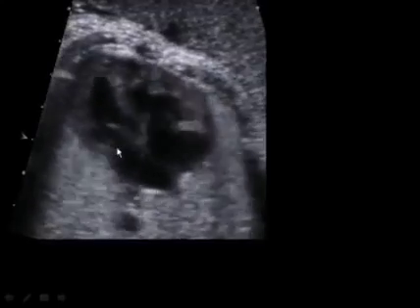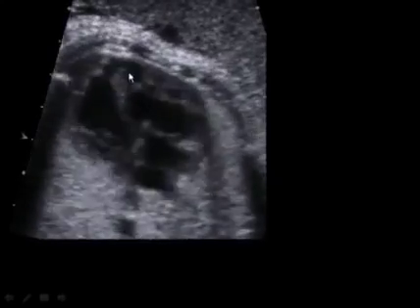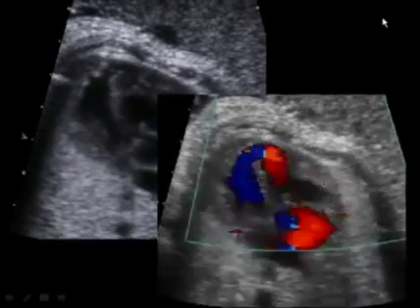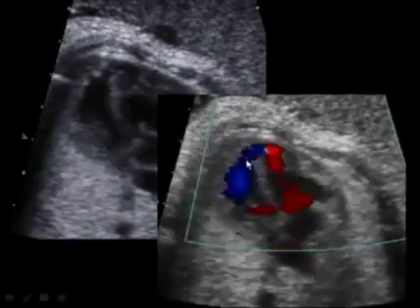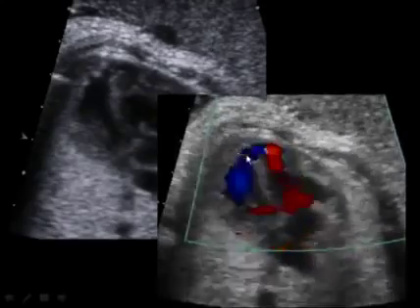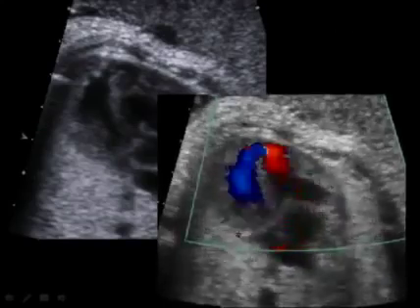Another what looks like a beautiful four-chamber view. We can see the tricuspid valve and the mitral valve, but if you look here on the very top of the apex, it looks like there's a black structure here on the end, and this is where color is helpful, because with color imaging we can see that there's a small ventriculoseptal defect in a membranous portion of the septum, in a very unusual location, but the color makes it very easy to see that ventriculoseptal defect.